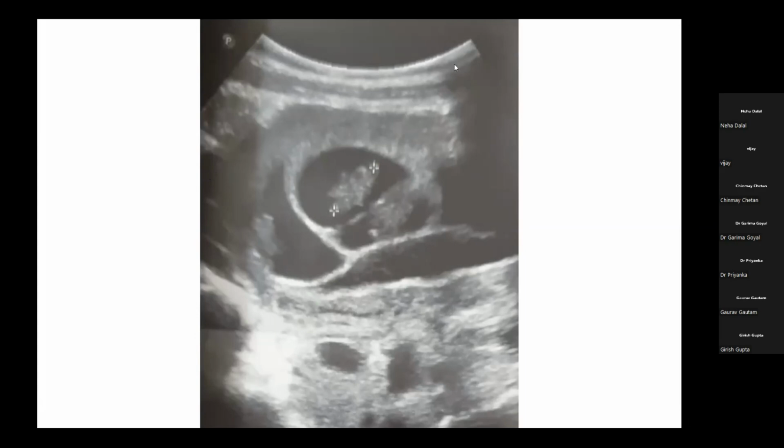All right. So basically, it is showing a triplet, 3 gestation sacs. These are the 3 gestation sacs representing triplet pregnancy. One sac you can see in the upper image, in which we are measuring the CRL length to see the gestation of the baby.